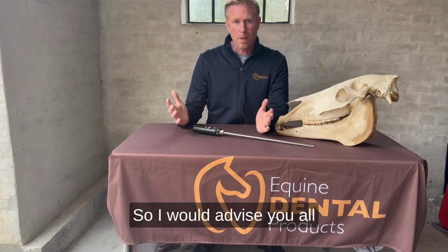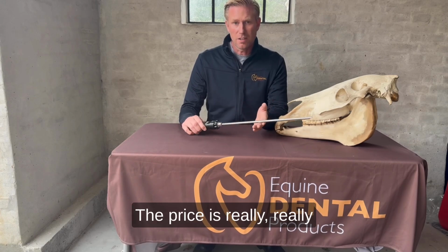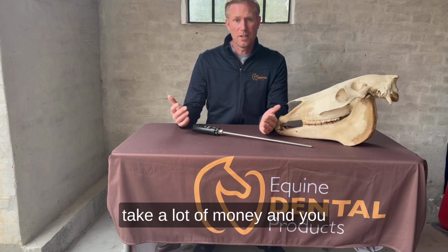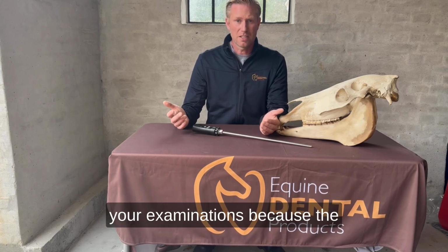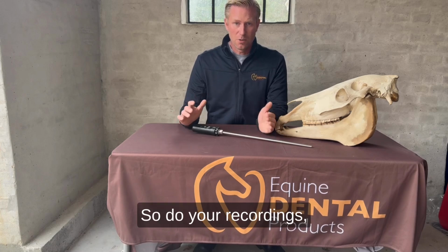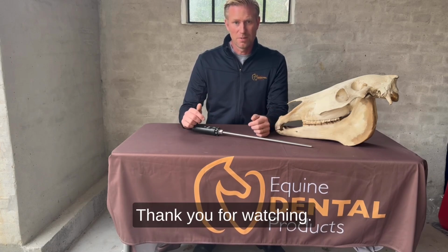So I would advise you all to start recording your examinations, and if you don't have a scope, get one. The price is really fair nowadays, and it doesn't take a lot of money, and you can easily get that back on your examinations, because the owners love when you're doing the examination with a scope. So do your recordings, get a scope. It gives you a lot of opportunities.